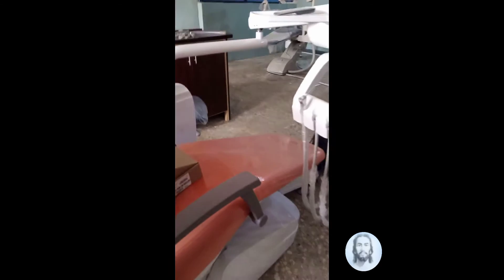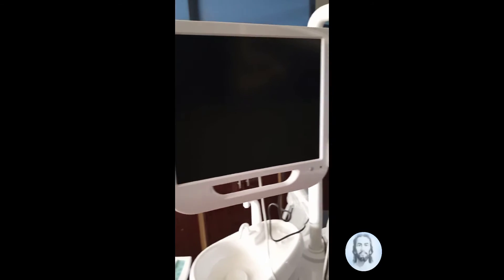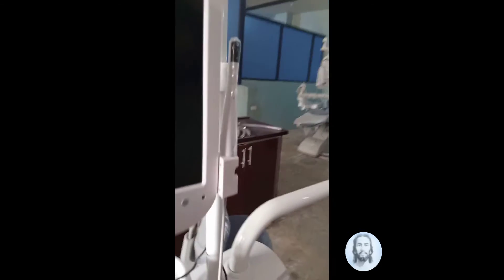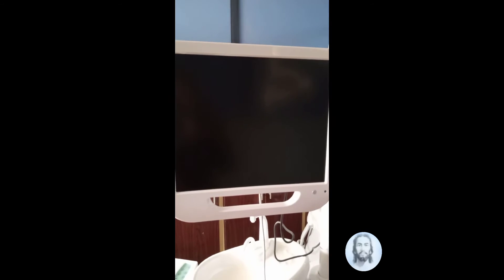Here is the dental monitor. Over here is the intraoral camera — this is the intraoral camera — which allows the patient to be able to view the procedure on the monitor.